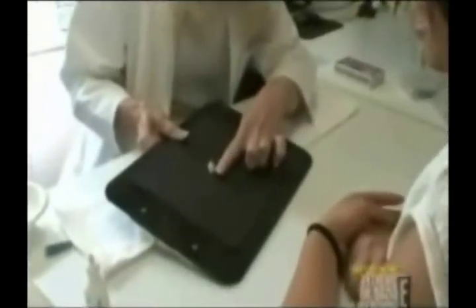Okay, Miss Gerilyn. That's nice. And this is for the lower lid to cover it. And you know where the bottom of the prosthesis is.